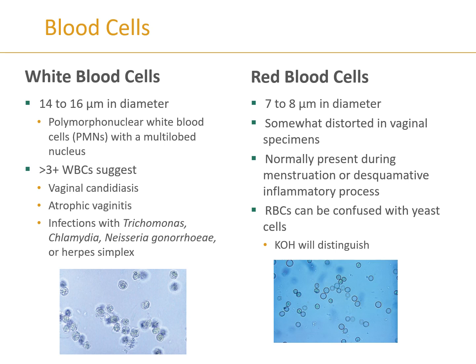They're often confused with yeast. They do have a very similar look in wet mount, so in order to distinguish those, you could use KOH, which would dissolve the red cells. So if you look in there and you think you've got yeast and then everything's gone, then you know you've got red blood cells. However, if some of the stuff is gone, but you still have those budding yeast present, then you know you've got both. What you're looking for is making sure that you actually see the presence of that budding in order to call it a yeast.